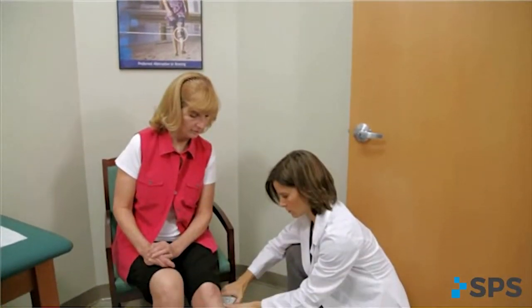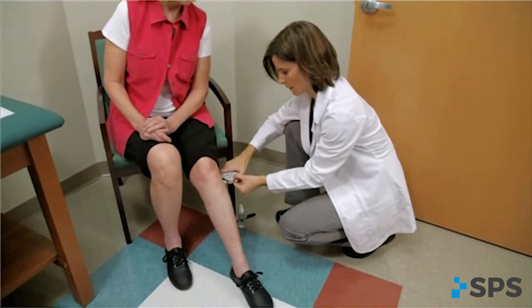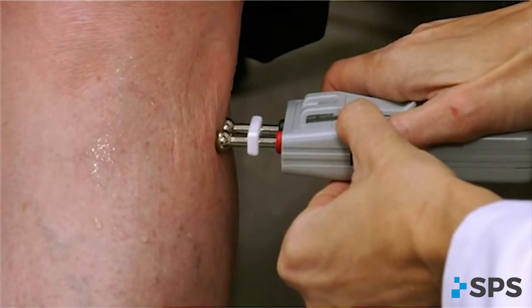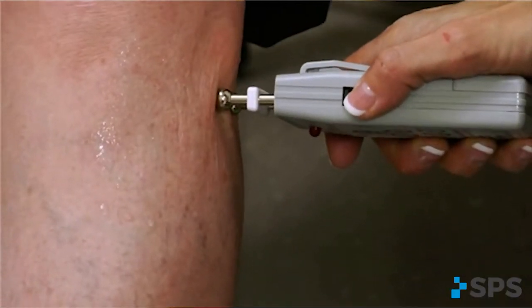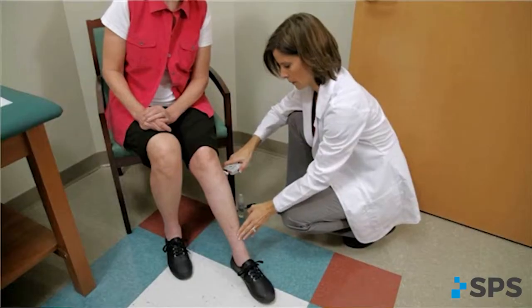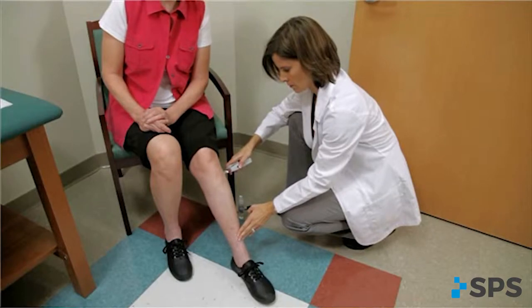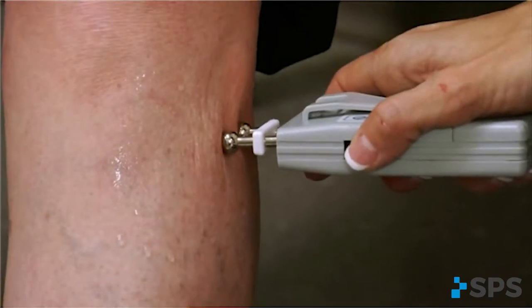As you slide the mini stim down and anterior beneath the fibular head, identify the point at which the muscle twitch occurs and the movement changes from eversion to dorsiflexion. This is the point at which the common peroneal nerve bifurcates and the stimulation shifts from affecting the superficial branch to the deep branch. Watch and feel for any slight twitch of the tibialis anterior muscle. Once the twitch is discovered, stop sliding the mini stim and slowly increase the intensity to confirm the appropriate response.